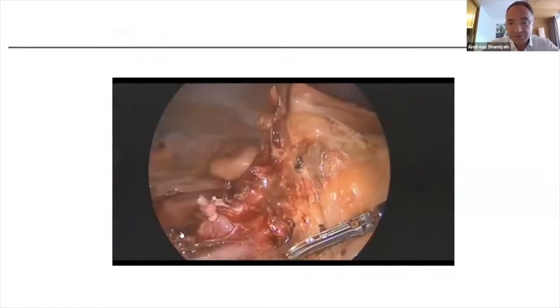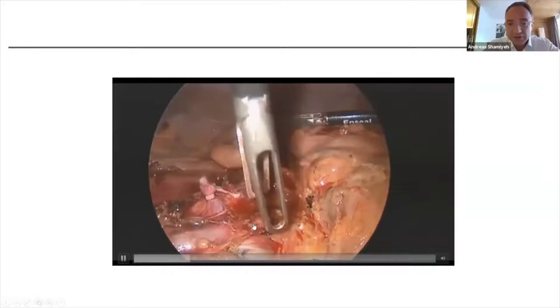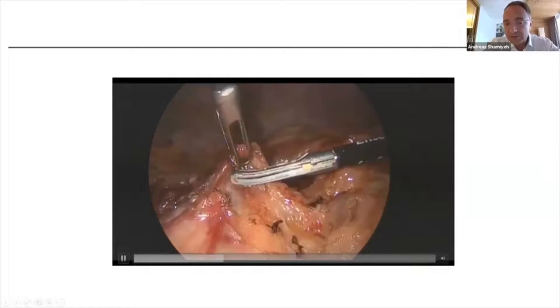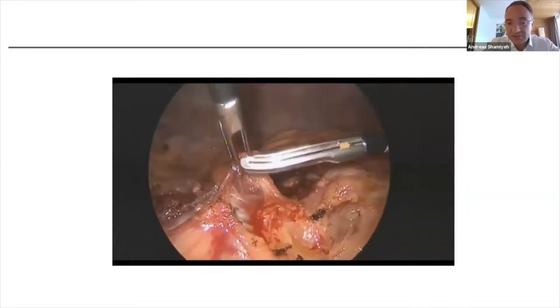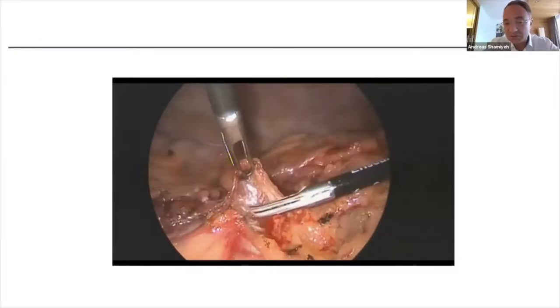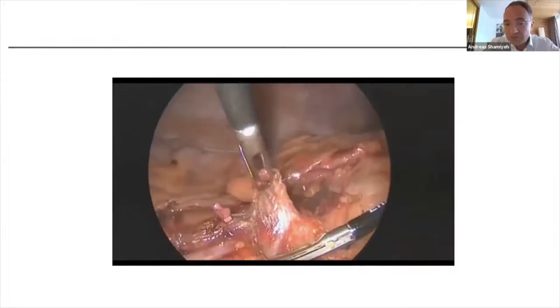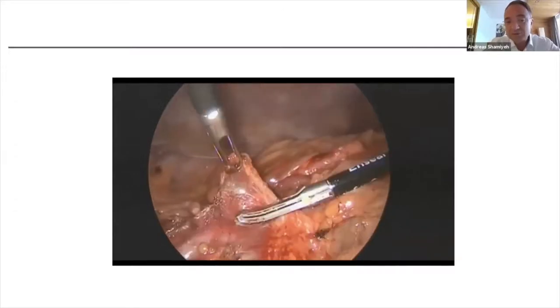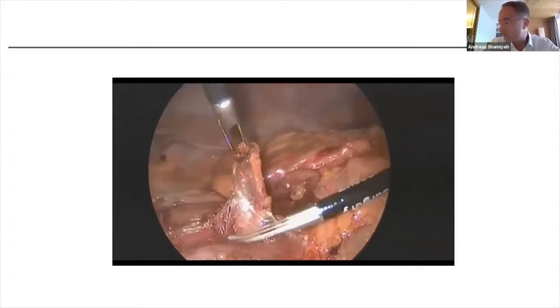In this short video, this is the vein. All surgeons say there are no nodes on the vein, they're all on the artery. But I show you the way to do it — which we never did in the open way — to follow the vein and check every lymph node and all the lymphatic tissue surrounding the vein, and of course also the artery. This makes this a really wonderful procedure if you feel comfortable, a demanding procedure, but one which gives a benefit to the patient in five-year survival.